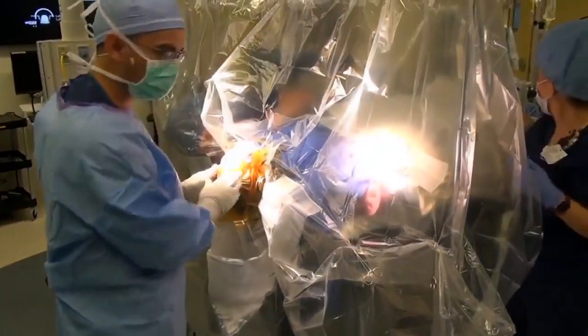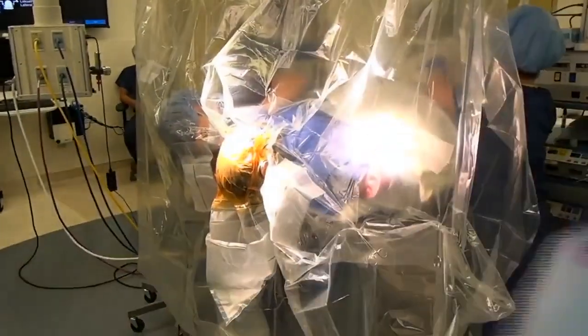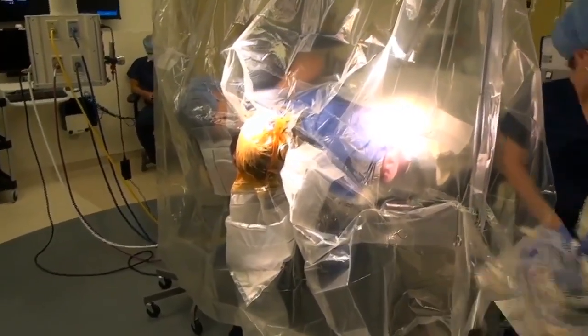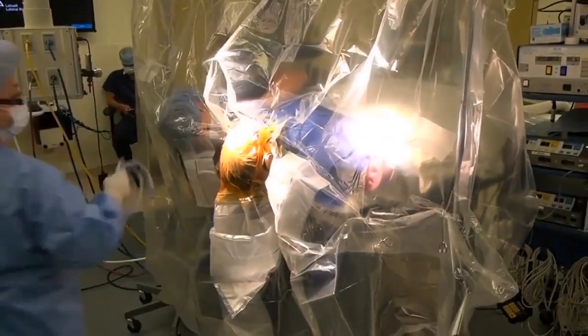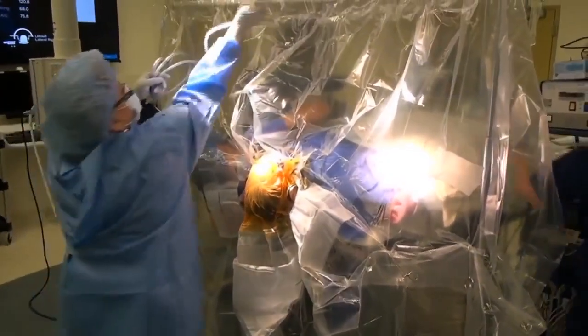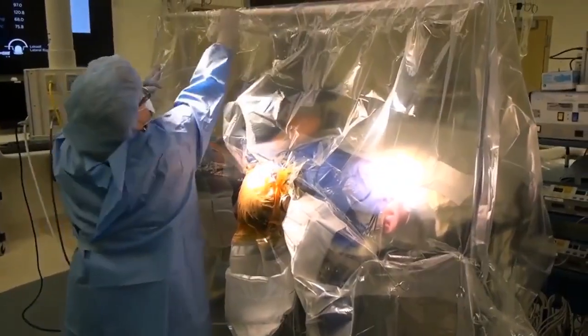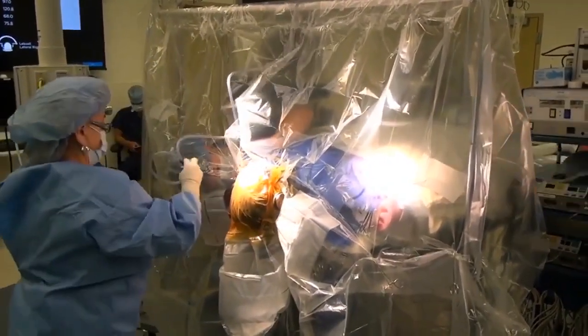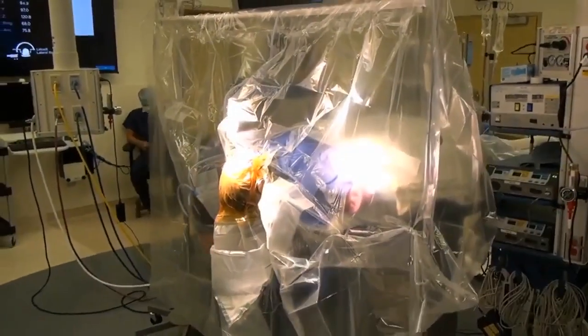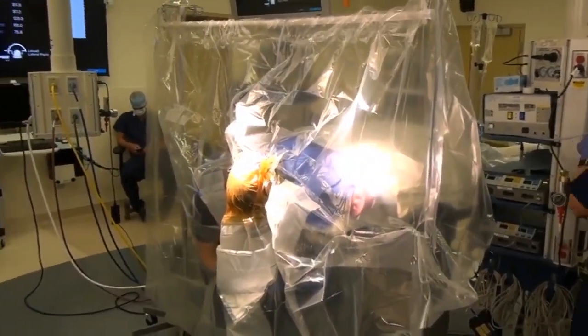Okay, all right, looks good. Check our coordinates here with Dr. Chua. 84.9, I think that looks good. Great, looks good. 75.8, good. 20.